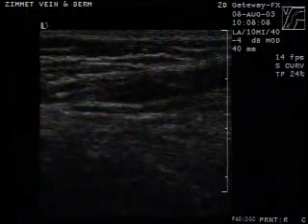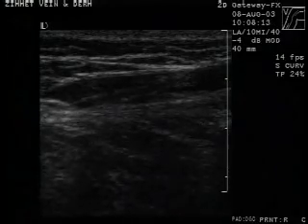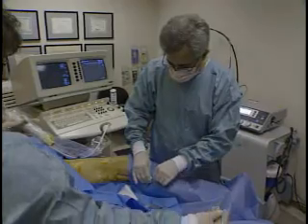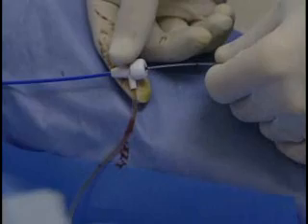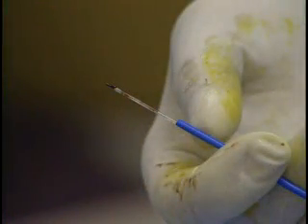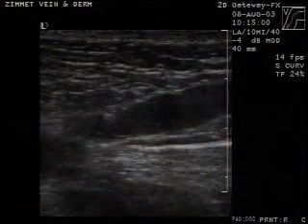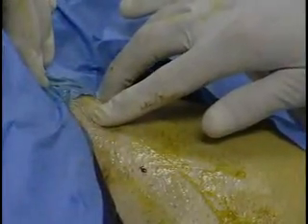Withdraw the sheath under ultrasound control until the tip of the sheath is about one centimeter distal to the SFJ. Intraluminal position is confirmed by aspiration of non-pulsatile venous blood. A 600 micron diomed laser fiber is inserted into the sheath and advanced up to the first sight mark, indicating that the distal tip of the laser fiber is flush with the end of the sheath. The sheath is then withdrawn to the second sight mark, exposing the distal three centimeters of the bare-tipped laser fiber. Verify that the laser fiber tip is about one centimeter distal to the SFJ with ultrasound and by checking the location of the aiming beam.